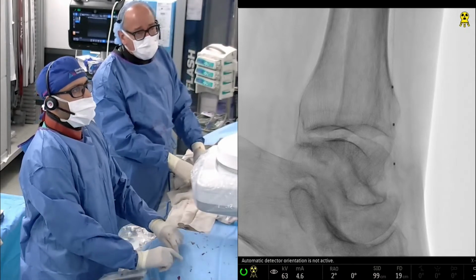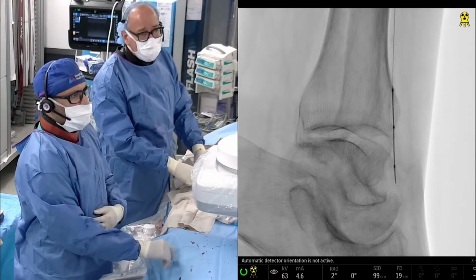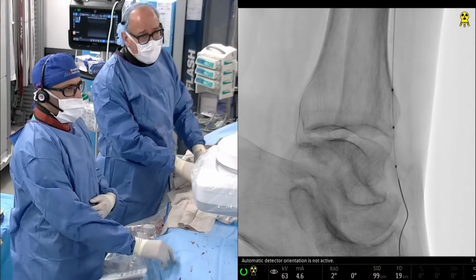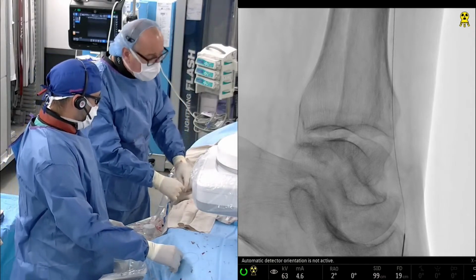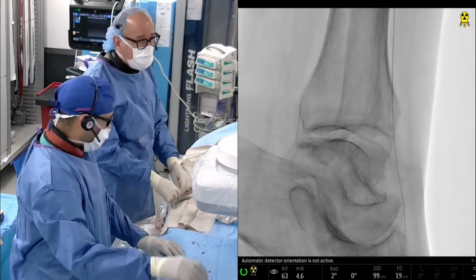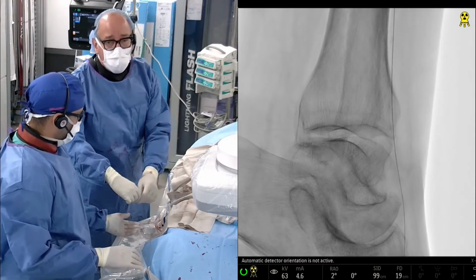And then the Grand Slam is a coronary support wire with a floppy tip. It is not designed to cross. And again, it goes right down the DP very, very well. And what I think I'm going to do here, just because that was a little bit easy, is I'd love to set up 014 IVUS.